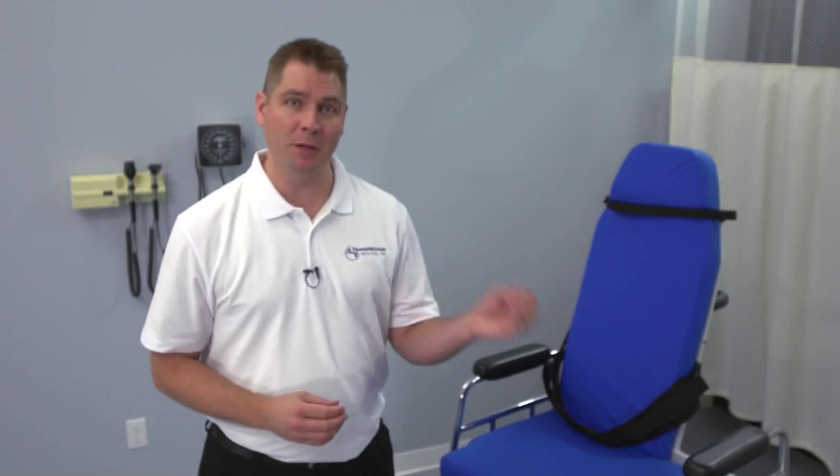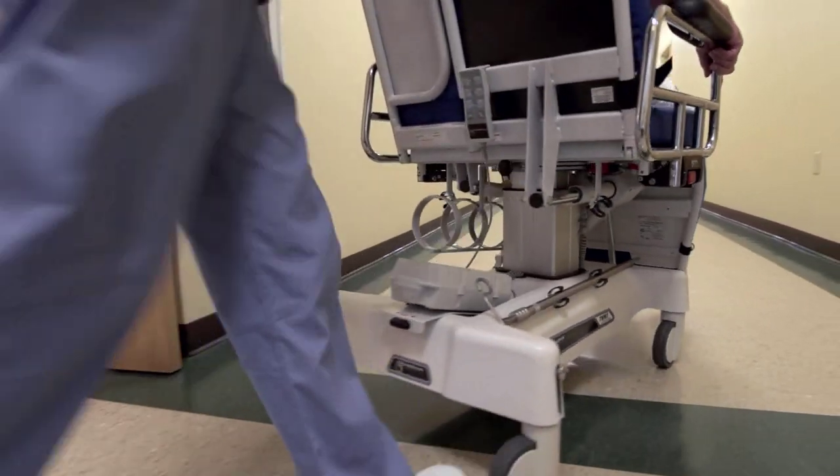At TransMotion Medical, we are committed to making patient handling safer for both nurses and patients. That's why we developed a concept called One Patient, One Surface. Every TransMotion Medical stretcher chair lets a caregiver take a patient from admission to discharge all on a single surface.